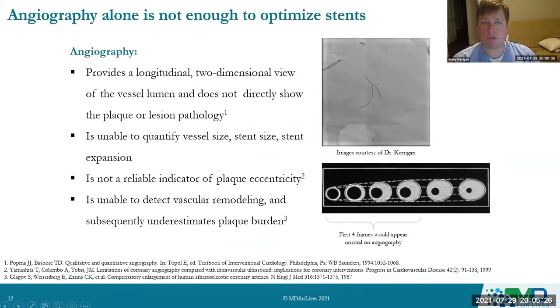Historically, people have used angiograms to assess whether or not a stent is adequate. As I showed you in those pictures, we take angiograms, we inject contrast dye in the blood vessels and look at the blood vessels from multiple different angles to look for any blockages as evidenced by haziness, by lumps or bumps, in some cases occlusions, like the case I showed you before. The issue is that this is, as I said before, a luminogram.